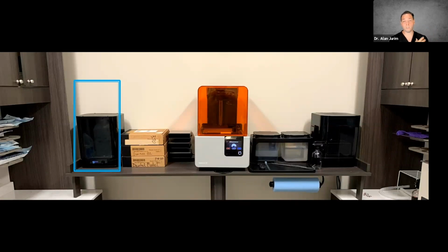For example, our full arch implant bridges that we print, we will color them and glaze them. Bite splints, we like to polish them and post-process them. Surgical guides need assembly. Dentures need to have the teeth put in. So there are some steps that happen afterwards, but most of the time, for the most common things we print, for example our digital tooth setups and the models, those go right from the wash into the cure, and they're off to be used with the patients.